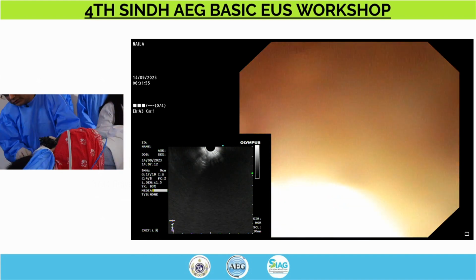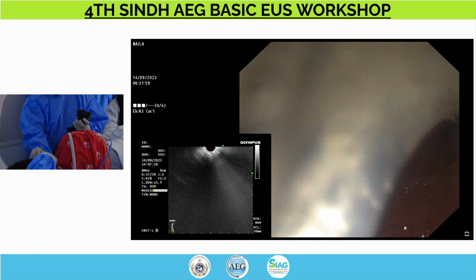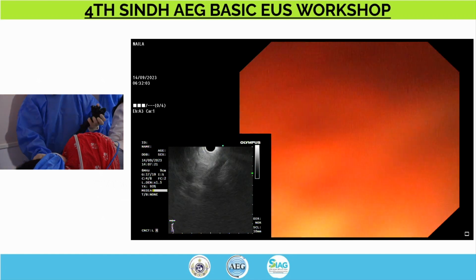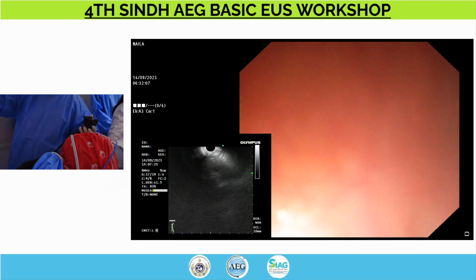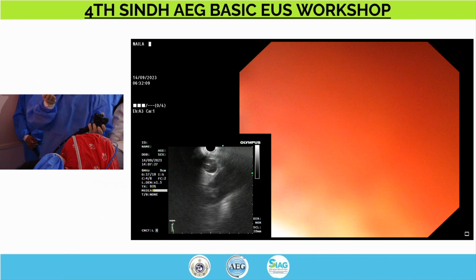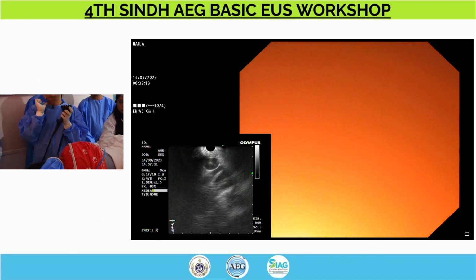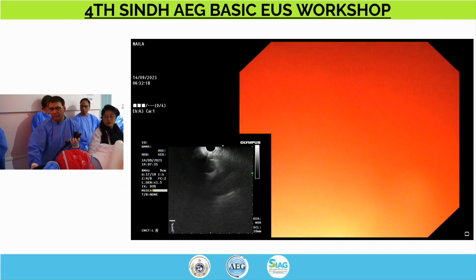आप इसको छोड़ दो, इधर से छोड़ दो, chin को छोड़ दो, not here. So if the chin is too high and it's being held up high, that could give you trouble getting to the oropharyngeal area. That's what was happening. So I asked him to release the chin because he was moving that chin up for the patient's breathing. So that could be problematic.